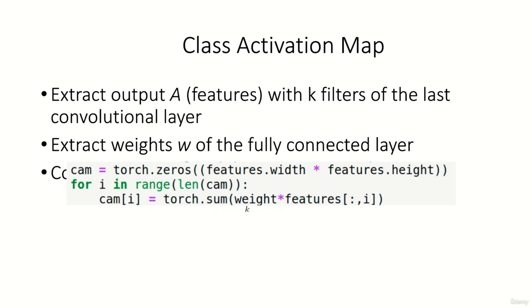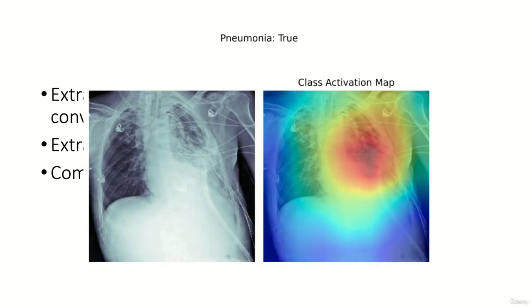When applying this procedure to an example of our X-ray classification dataset, it returns the following class activation map. In this example, we can see that the somehow noisy looking right part of the lung supports the classifier to output pneumonia. And in fact, this milk-like appearance is a pneumonia. Isn't that great? We just extracted the knowledge of our classifier to produce a heat map showing signs of pneumonia on the image.